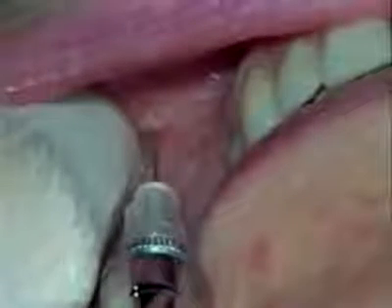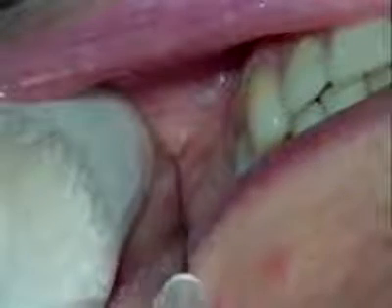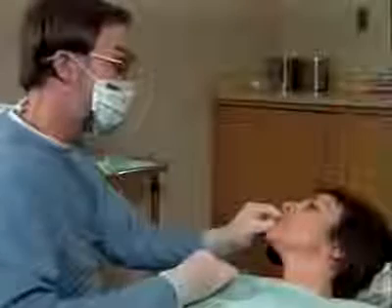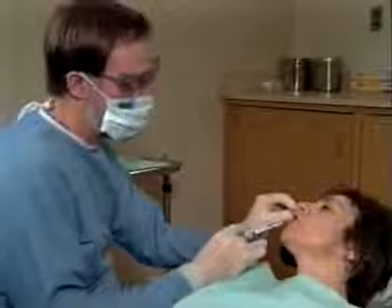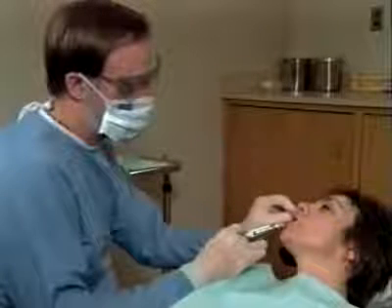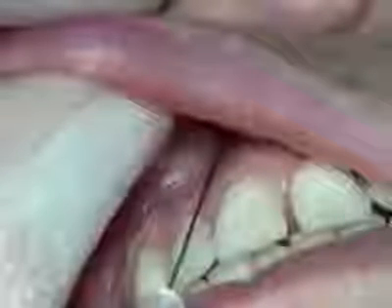As with all other injections, the needle is then slowly withdrawn. Because of crossover fibers from the contralateral side, anesthesia of the central incisor may be incomplete unless a supraperiosteal injection is made over that tooth.